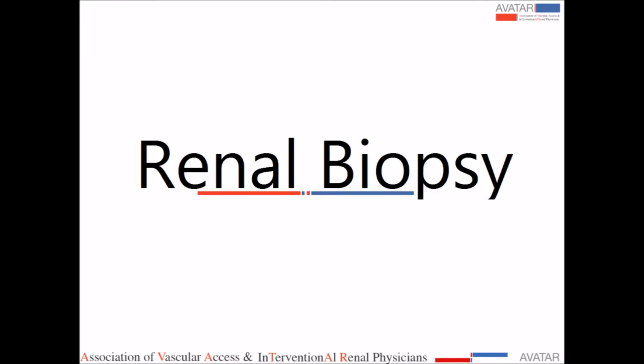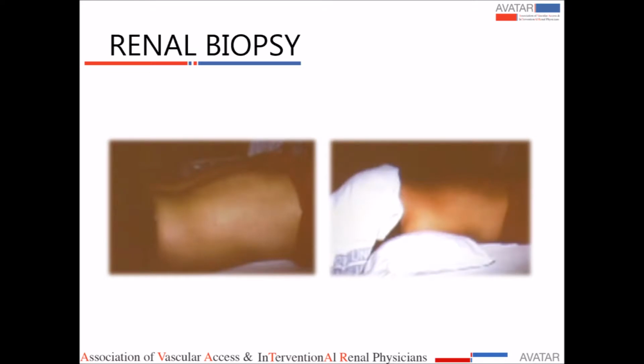renal biopsy. All of us at our institution do our biopsies at the bedside. When I trained 20 years ago, Dr. Narula used to do them blindly, and I think we leave that to the masters, but all of us now use ultrasound for guidance, and we do it at the bedside. It takes out the difficulty of trying to coordinate with the radiologist, and they're always trying to turn down a procedure for some reason at our institution. So we just do it at the bedside.